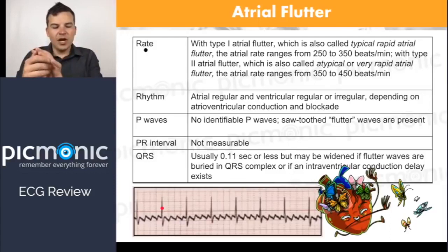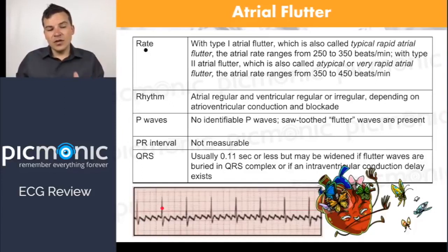Well, if I folded this into an origami set and cut it and laid the pieces on top of each other, it's doing the same thing over and over and over. People would be very cautious to call this regular. Well, it's irregular, but it's regularly irregular. It's doing the same thing wrong over and over and over again. So that's regularly irregular, that's right.